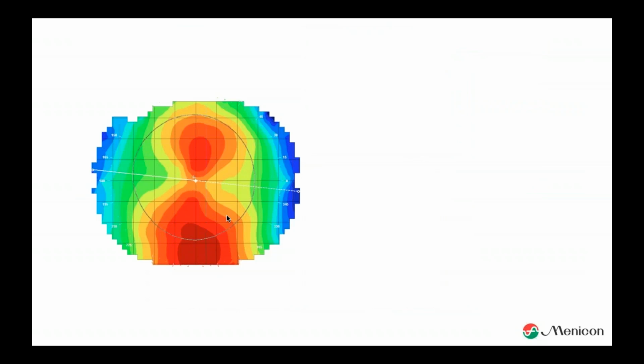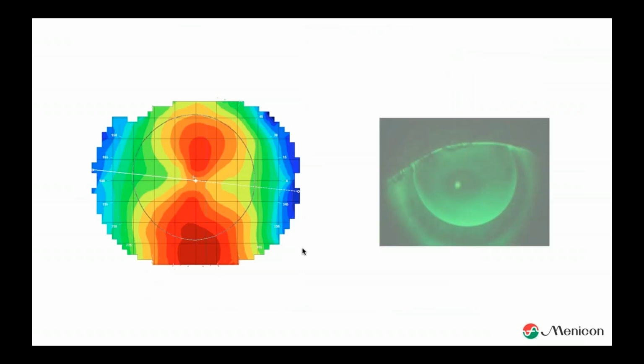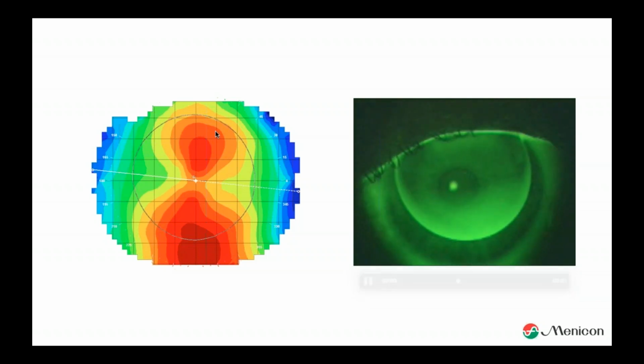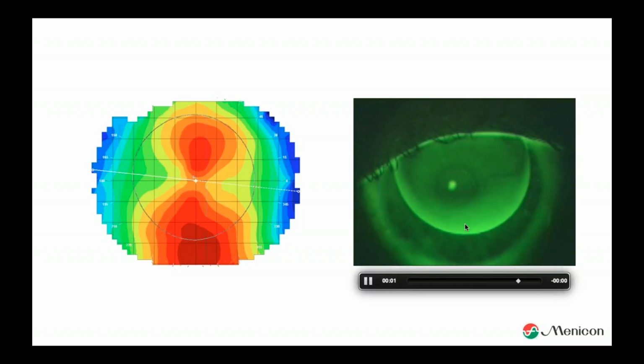I have an example of that. When I put a lens on the eye, you will see the upper eyelid get a grip on the lens and take it upwards. This is what I would definitely call a high rider, because you expect it downwards, and now it is upwards. You have to manage this, because otherwise you deform the cornea. You will end up with warpage. You will see a lot of fluorescein over here because the eye is steep over here.